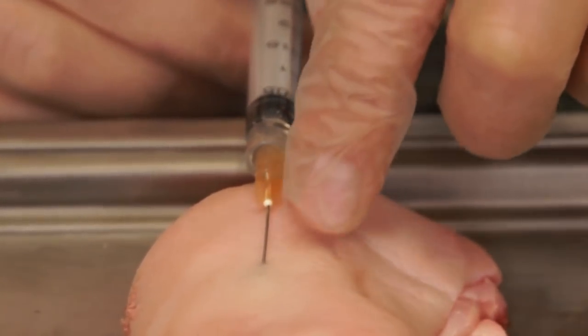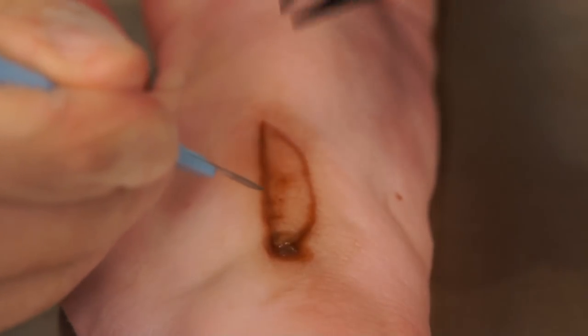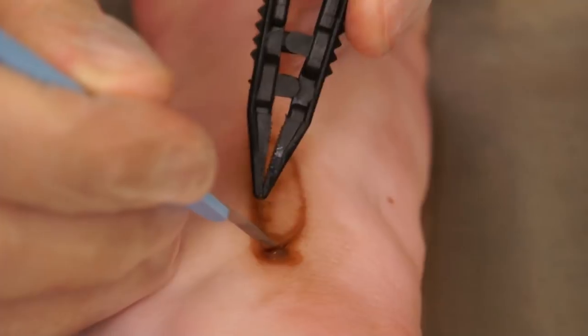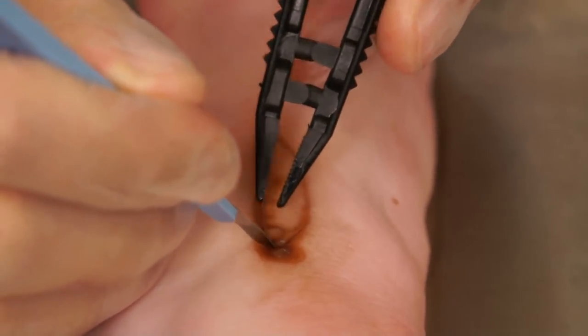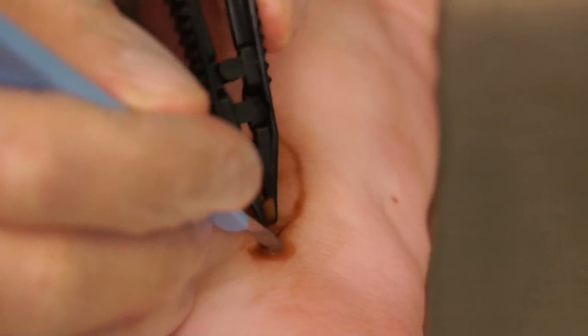Once adequate anesthesia has been performed, the necrotic area is addressed. A number 15 scalpel or a dermal curette can be used. Oftentimes a forcep is also helpful. Initially, the leading edge or interface between the normal skin and the necrotic area is identified.